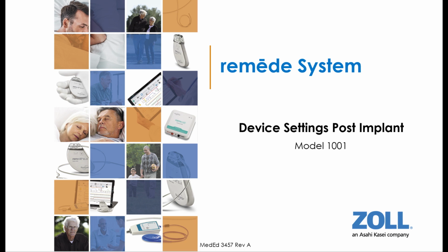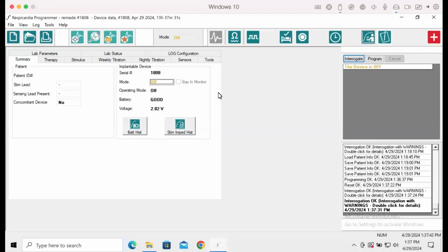How to set up the remedē device post-implant for a remedē model 1001. How to set up the remedē device post-implant to ensure success at the therapy activation visit. These steps are after initial interrogation and require the wand to be placed over the patient's device.